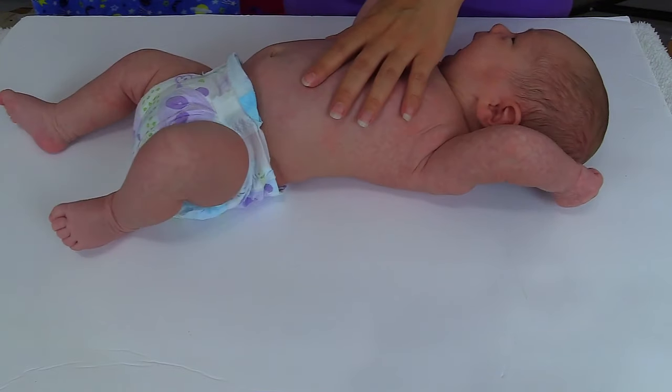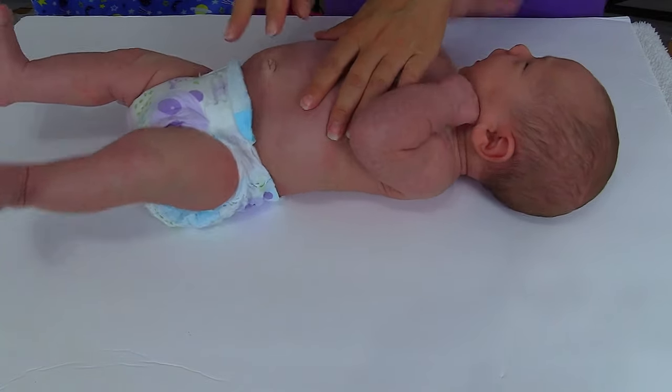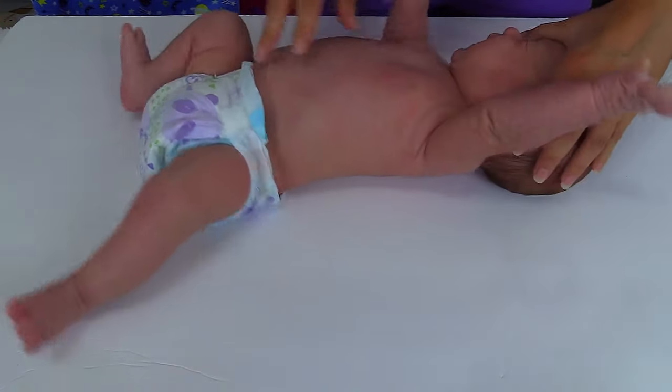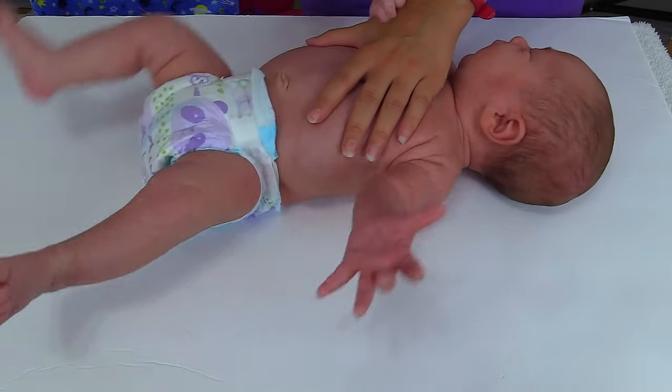To measure length, you want to lay the baby on a surface that you can mark. You'll need a pen for this, and you may need someone's help to measure the baby, because you're going to measure from head to heel.